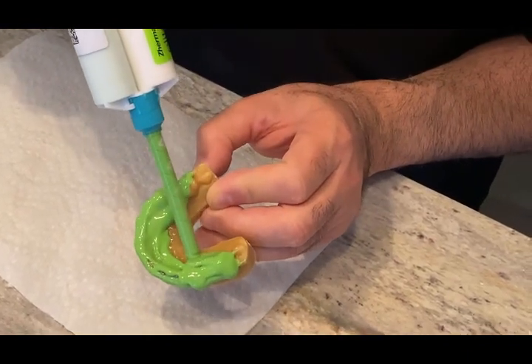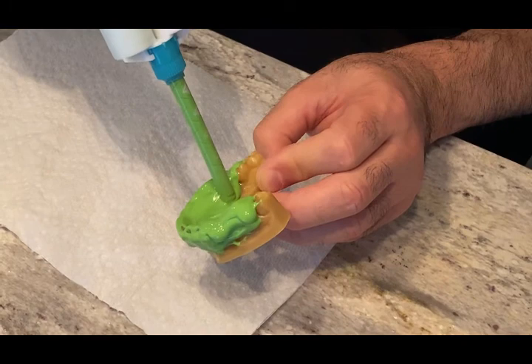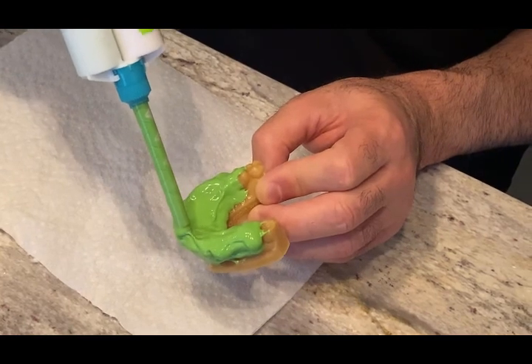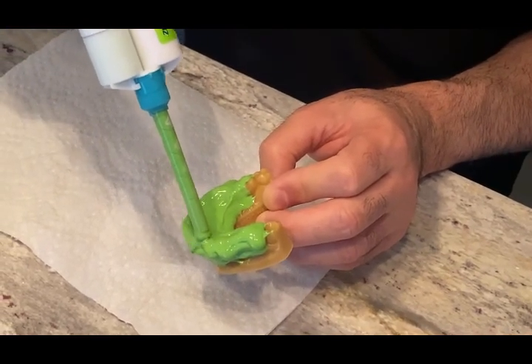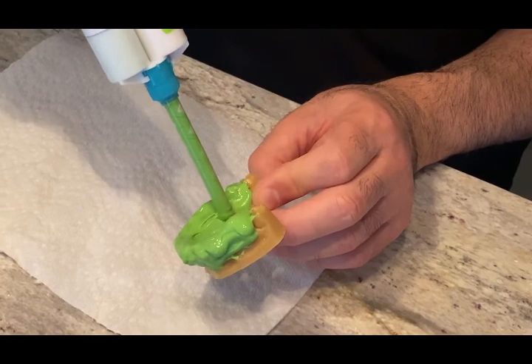You're on the lingual, because those are crowns — make sure that's detailed. For the palate, I normally capture the palate so there is a rest position. This one is only 10 units, so it's no problem because the adjacent teeth will hold it down and it doesn't slide around. But for full arch cases, I normally capture the palate so it doesn't slide around and the doctor can position it right.